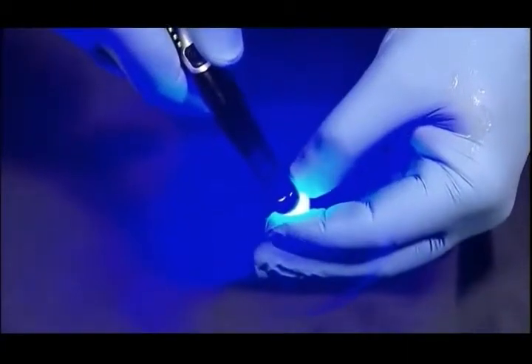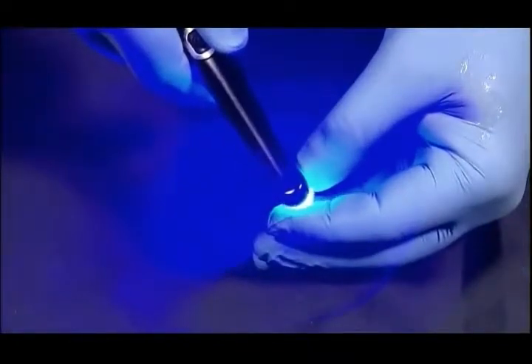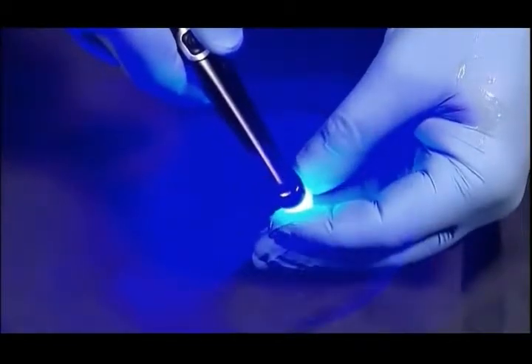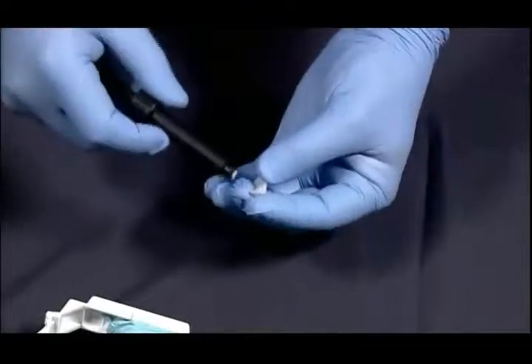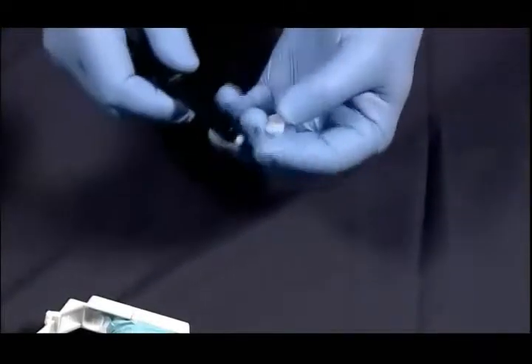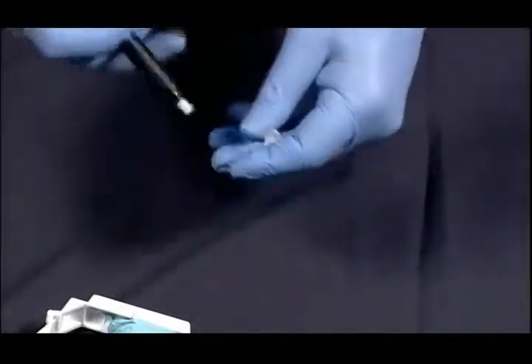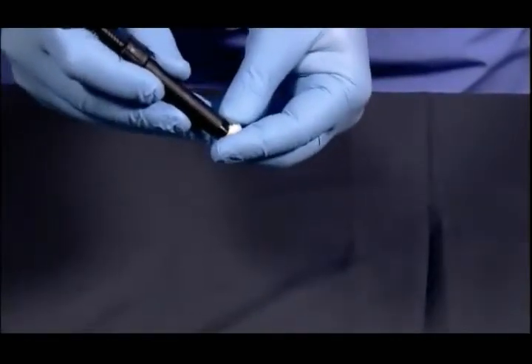So you're going to cure that for 10 seconds. And once you're done curing it for that 10-second cycle, what you're going to want to do is not touch that surface, because what you have is an oxygen-inhibited layer that will allow the composite to stick to it very, very well. Now the next step will be taking a fine composite material that is in the proper shade for what you're working on. We're working on an ivorine tooth, which is a very opaque ivorine tooth, so for this case we're just going to use a B2 composite. A good material that will give us very good form.